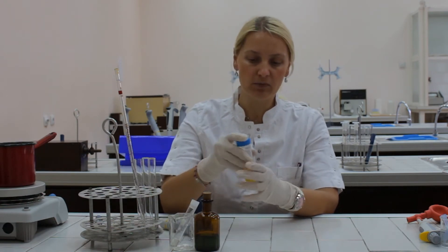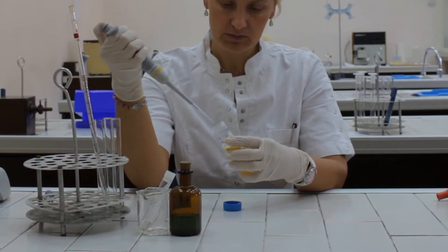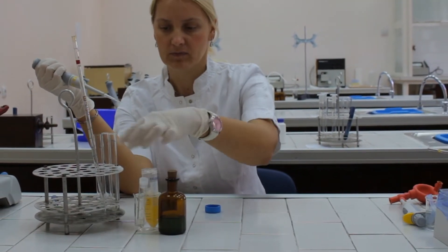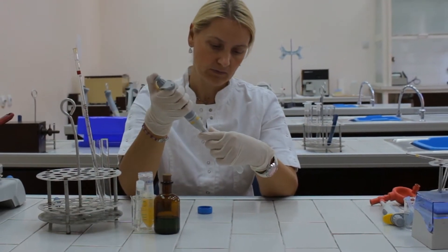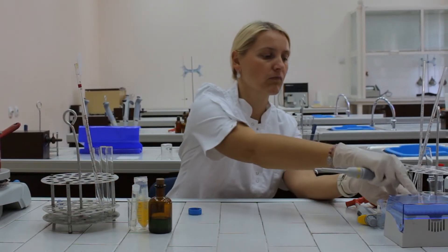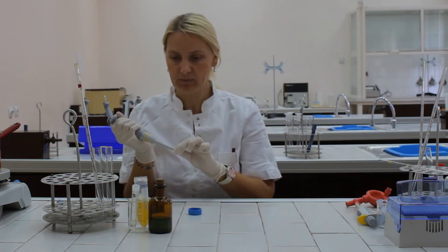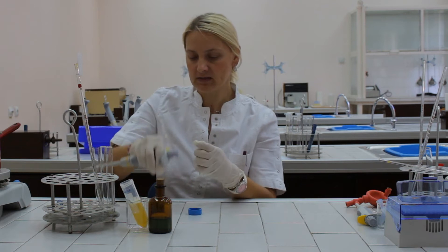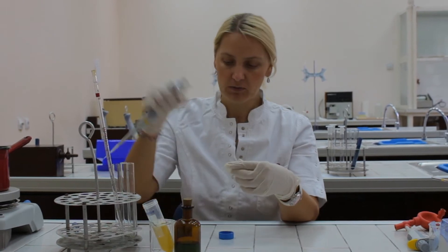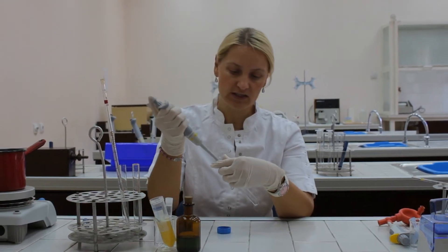We have to pipette the sample of blood plasma, 50 microliters, to the T test tube. Take another clean tip and now we have to pipette 50 microliters of standard protein solution to the S test tube.